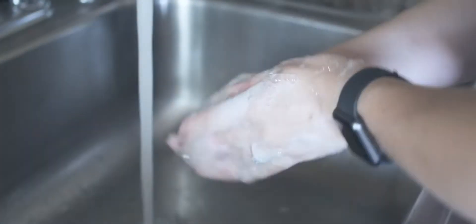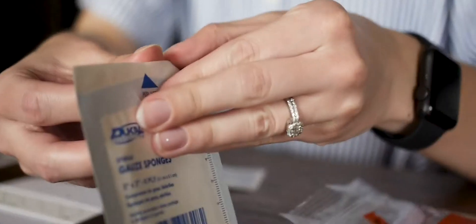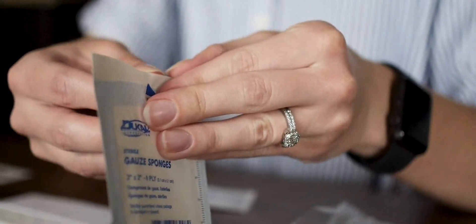Step 1. Clean your hands with soap. Wash under warm water and dry thoroughly. Open the cotton gauze for easy access during and after the completion of the collection.